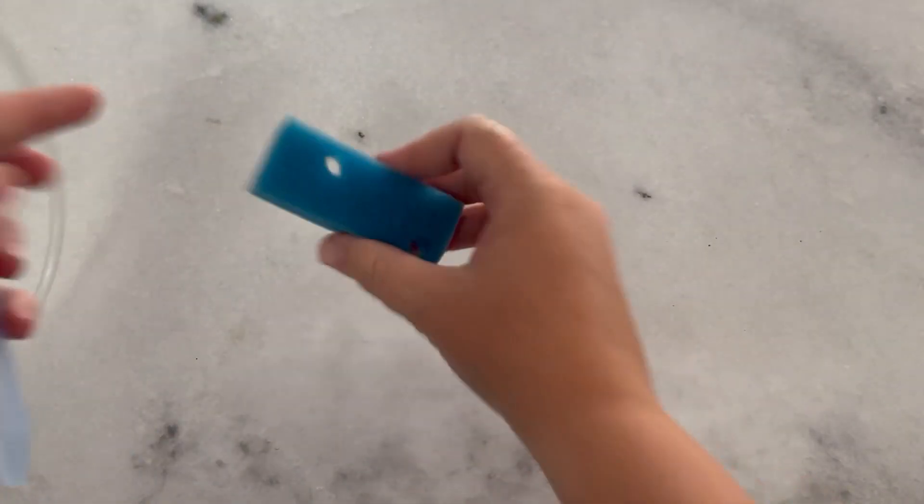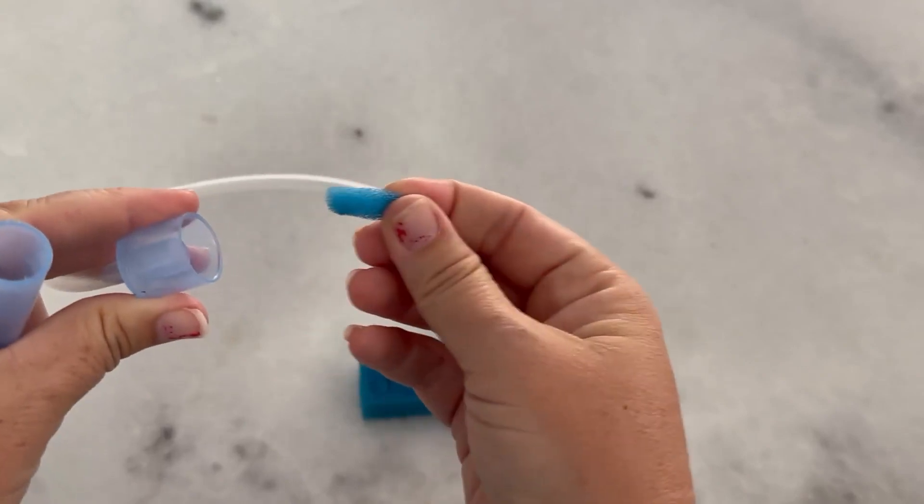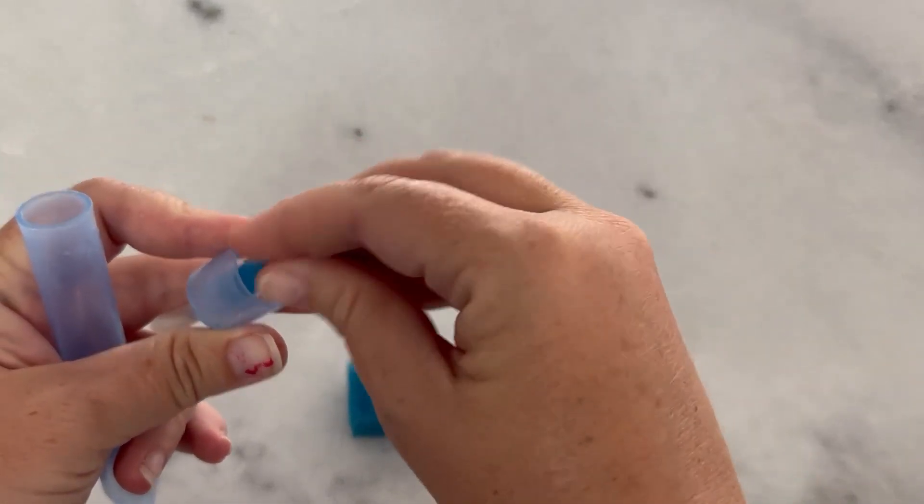It comes with all of these filters here. As you can see, you just pop them out. You take the filter out, take one out, and then pop a new one in when you need it.